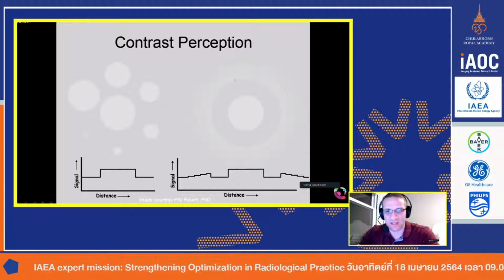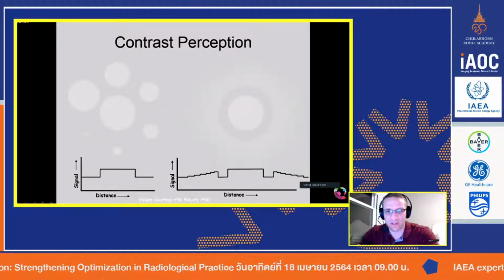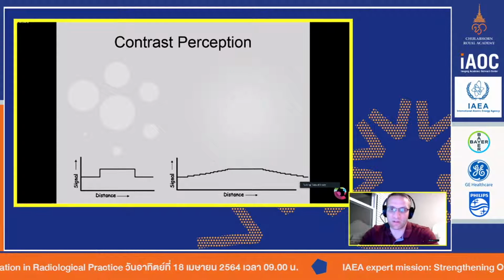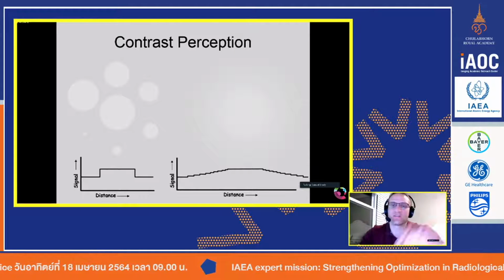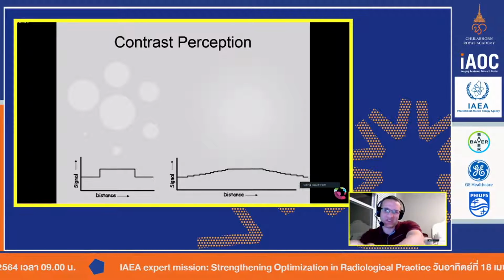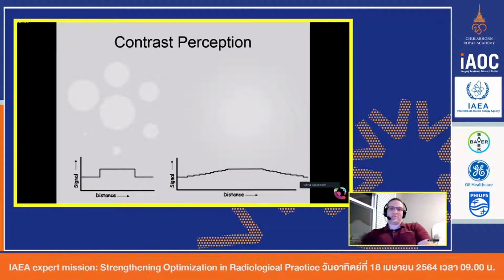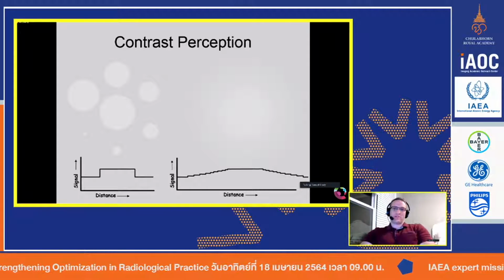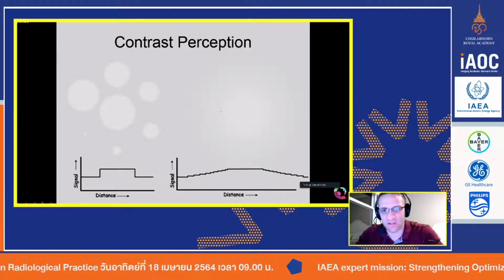Why? There's a distinct edge. You can see this edge. I'm going to add another one, and another, and another. Now I'm going to add the final ring, and all of a sudden they all technically disappear. Now, you've seen the rings, and so maybe if you sit there and squint a little, you can say, hey, I can see those rings. And if you lean back away from your monitor, our eyes see contrast better when we put a little bit of distance. And so here you can see that they're gone.